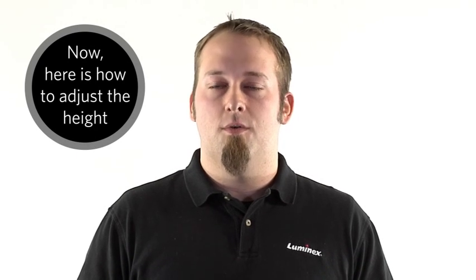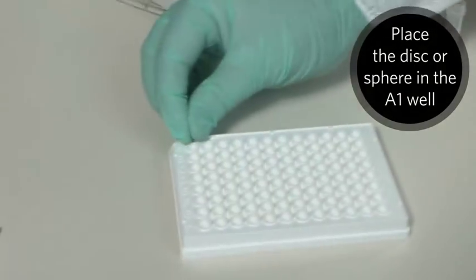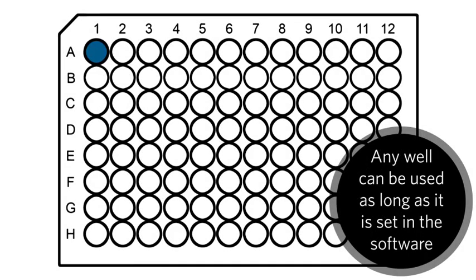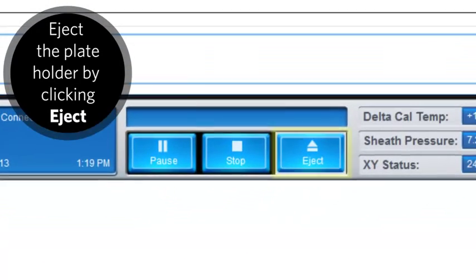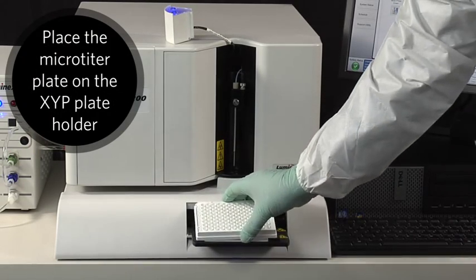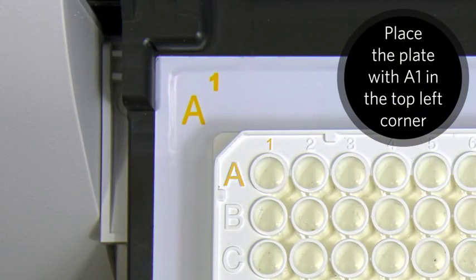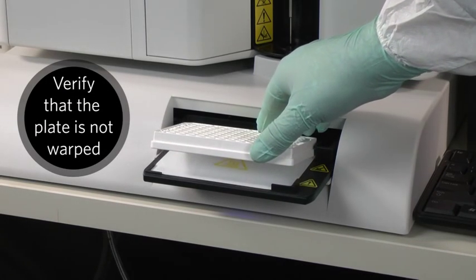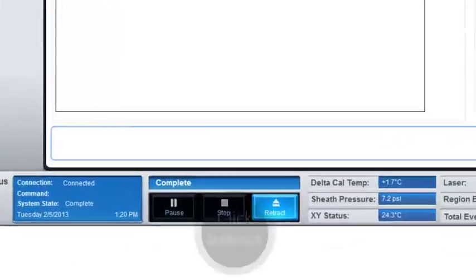Now that you know what to use, here's how to adjust the height. Place the appropriate alignment tool in the A1 well in the upper left corner of the plate. Any well can be used for the height adjustment, as long as you remember to designate the new well in the software. Using the Exponent 3.1 software, eject the plate holder by clicking Eject. Place the 96-well microtiter plate on the Luminex XYP instrument plate holder with position A1 in the top left corner. This is also a good time to verify the microtiter plate is not warped, as a warped plate can throw off the alignment. Click Retract. On the Maintenance tab, open the Probe and Heater section.